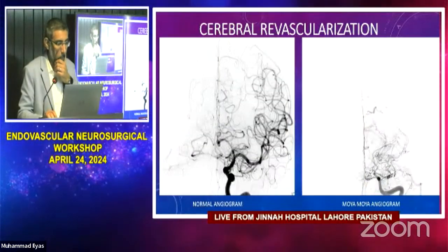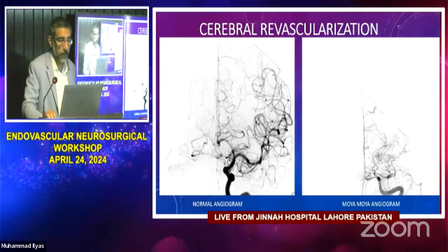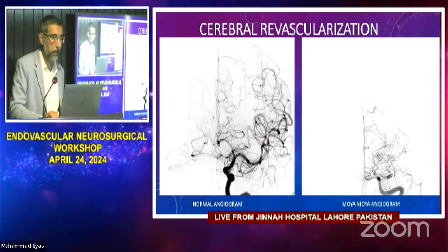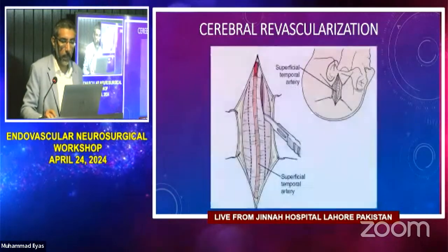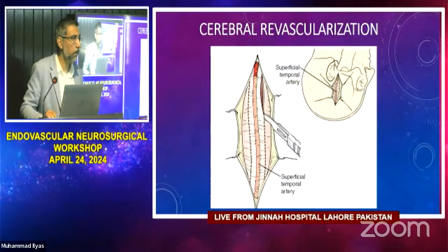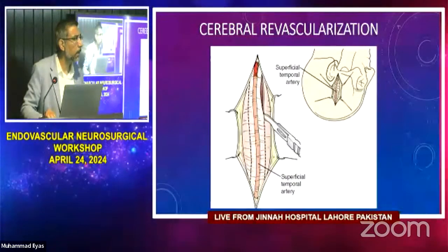So this is a normal angiogram to your left. A moyamoya angiogram looks like that, right? The distal ICA terminus looks bad, and you have all these hypertrophied lenticulostriate vessels that are essentially the moyamoya vessels, right? And so, do you do STA-MCA bypasses here commonly? No.